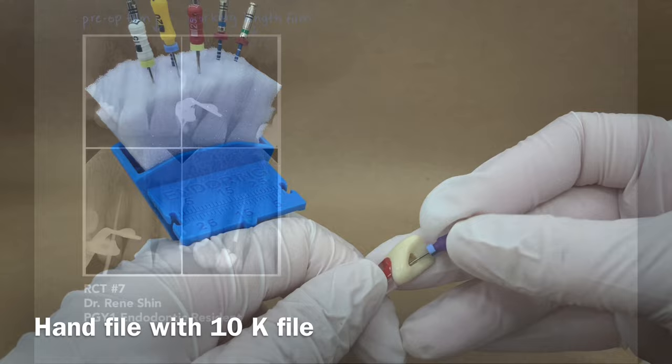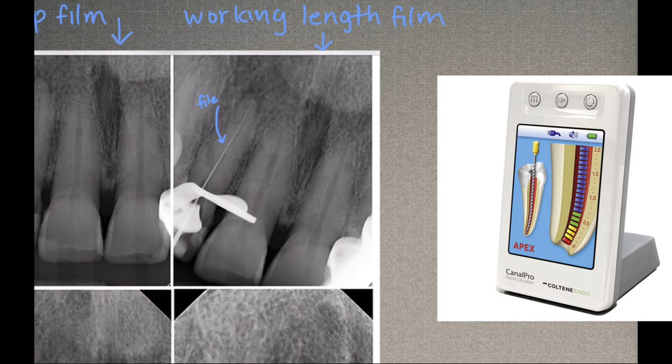In clinical practice, the working length is determined by using an apex locator and or taking a working length radiograph with a file in the tooth.